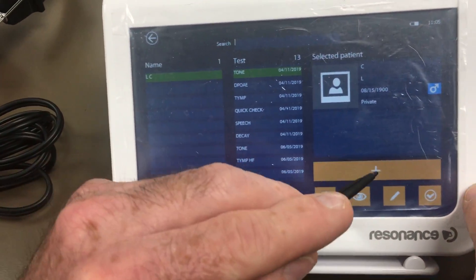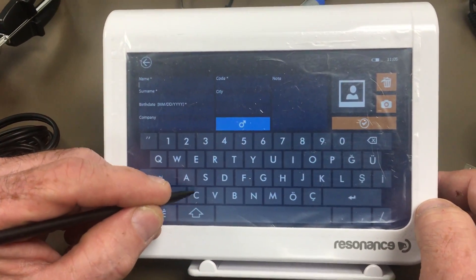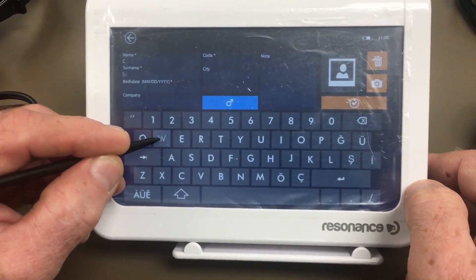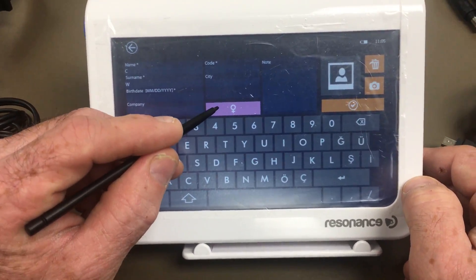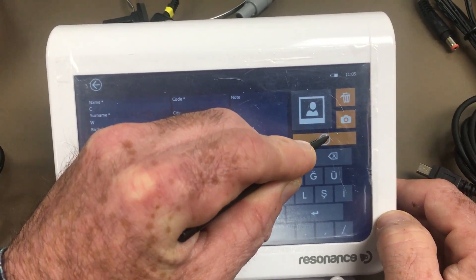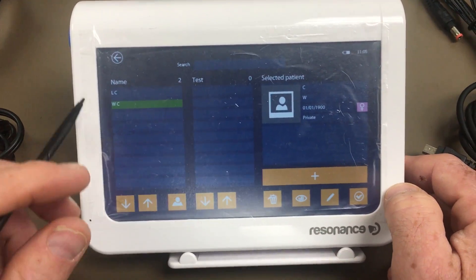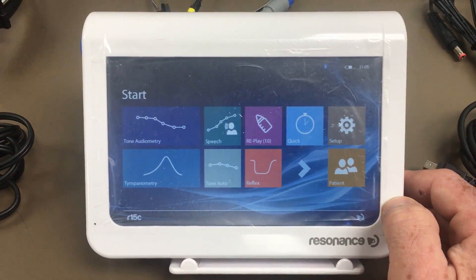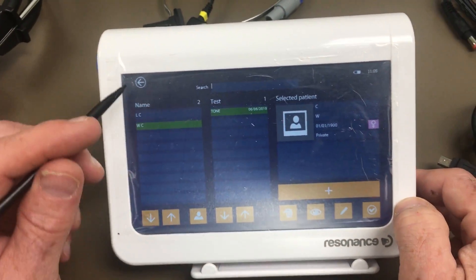If your patient isn't listed, you can click to add them. Fill out the last name and first name, date of birth, and gender. Once you've filled all that out, hold the button down for six seconds to save. Then select the patient, go to the bottom, and hit the checkmark to assign the test to that patient. When you go to the patient list, you'll see the tone audiometry test listed under that patient's name. To review it, highlight the patient's name, tap the eye icon, and click left or right to navigate. You can also print to an external wireless printer.